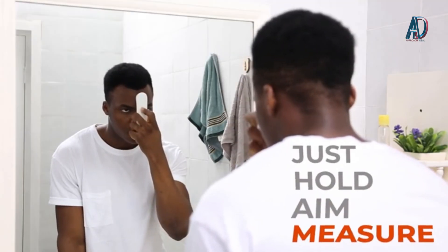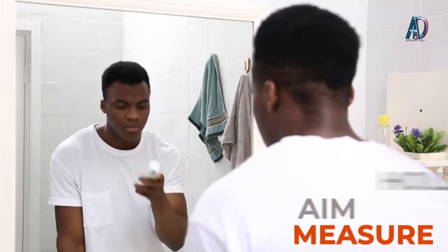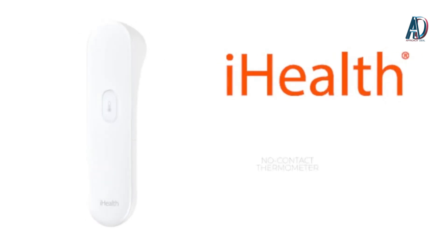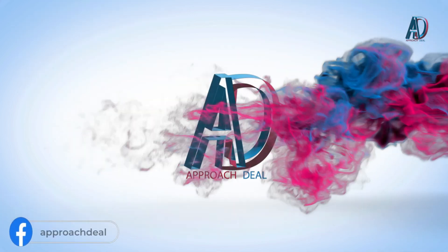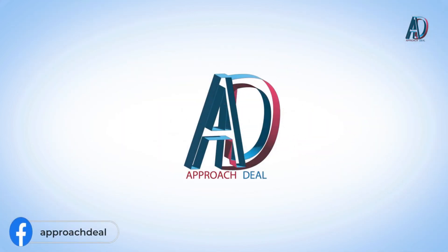Just hold, aim, and measure. That's how easy it is to take a temperature with a no-contact thermometer from iHealth.